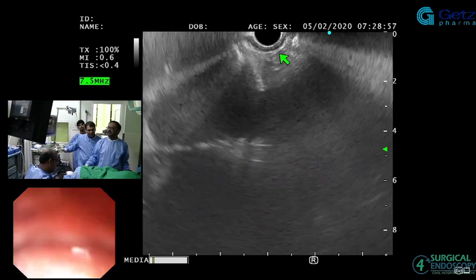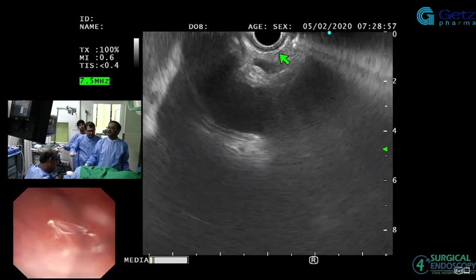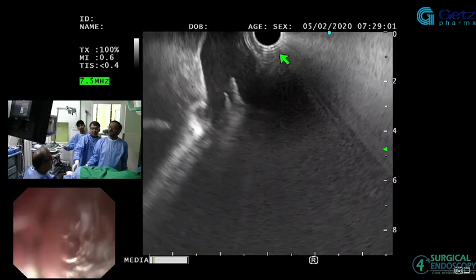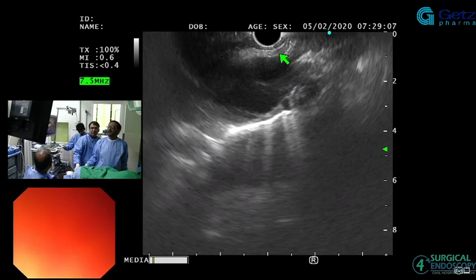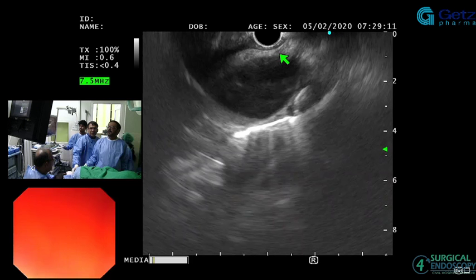Okay? No, you have to rotate. Right there, or pull back. When the aorta comes, big wheel a little bit towards you. Gently advance it. Big wheel towards you, please, a little bit. And rotate to the right. Right. Perfect. Pulmonary artery?